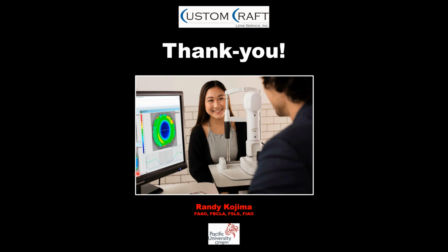Once the instrument is in place, have your second set of hands pull up on the eyebrow. Just dragging up on the eyebrow is often enough to get the upper lid a ways out of the road, and then we get a few more rings, a few more data points, and sometimes we can even get 100% of the superior cornea. So it really can be a helpful way of getting more information.